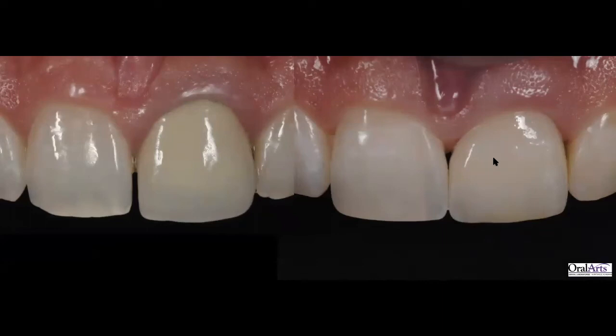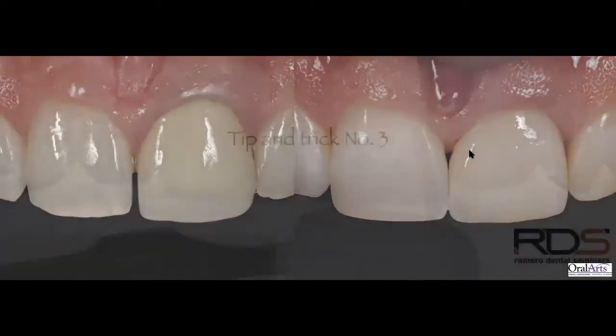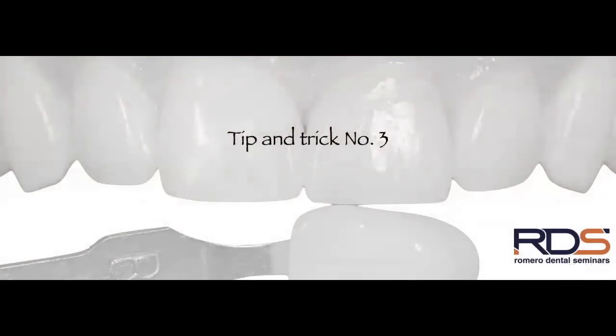And you can see it here delivered. And I just want you to compare the before and after. Now, if you ask me, is this a perfect, imperceptible restoration? My answer to that question is no, it's not. This is an acceptable restoration, acceptable to the patient, acceptable to me. And again, you're looking at a very, very close up of the photo. But when you look at this in the patient smile, and I do have the patient smile, it really just blends in very well. And it blended in so well that again, it was very acceptable to our patient.